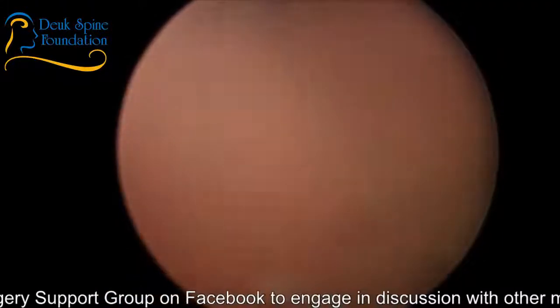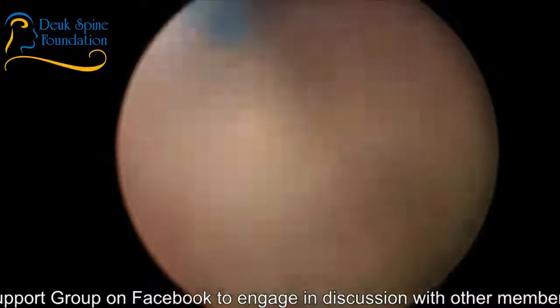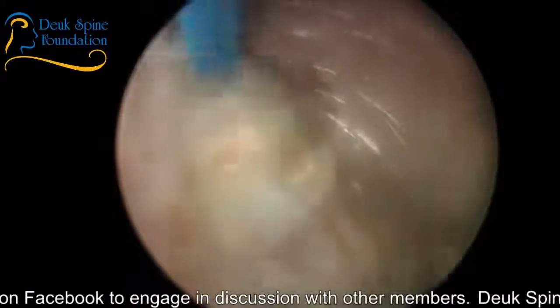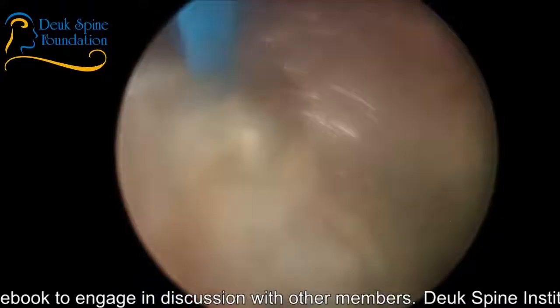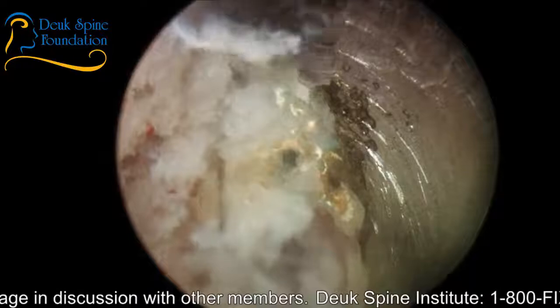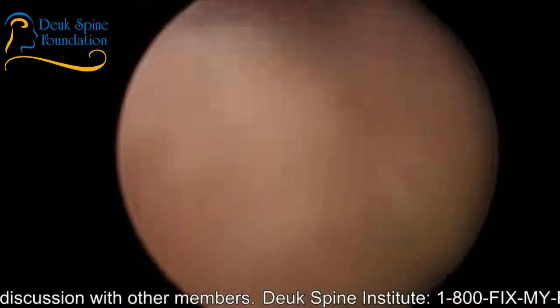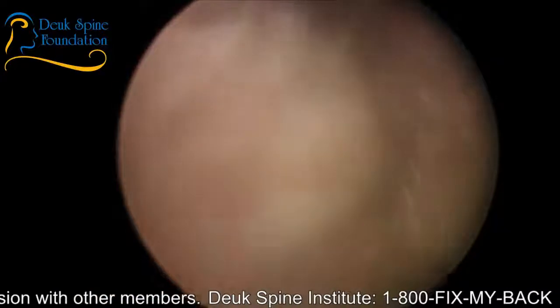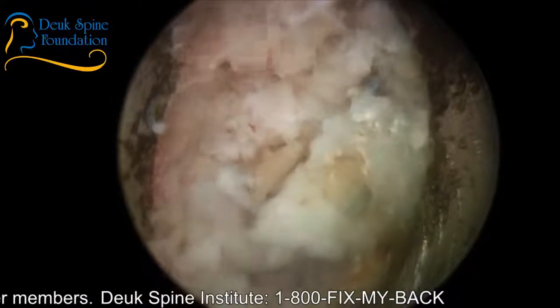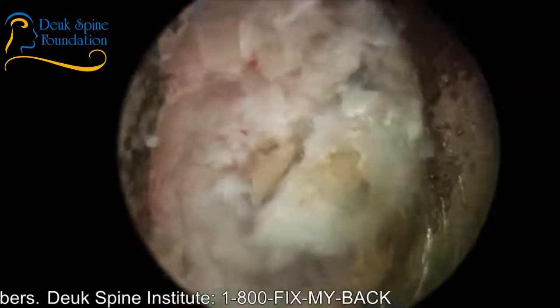Unfortunately, I can already tell you this is going to be a little bit bloodier of a case from the standpoint of there being more bleeding, which makes your view through the endoscope, and mine, by the way, worse. Okay, so if you look, it's kind of hazy. The haziness, reddish haze you're seeing is blood. And it's coming from the end plate right over there to the left. Okay, you see it coming there?